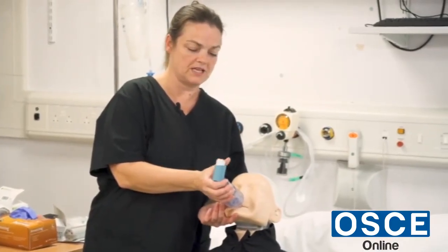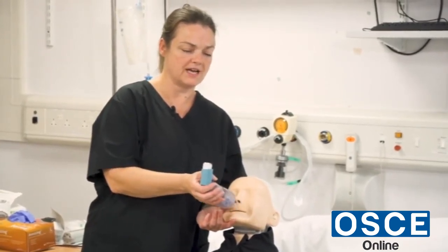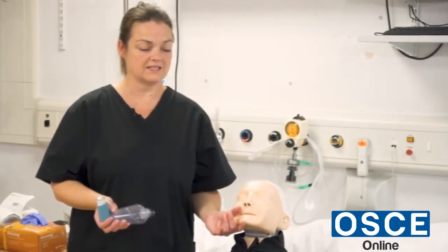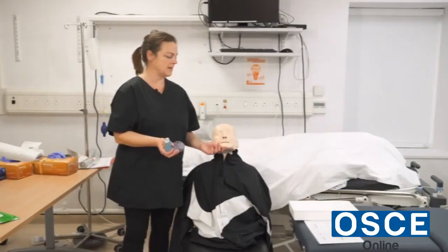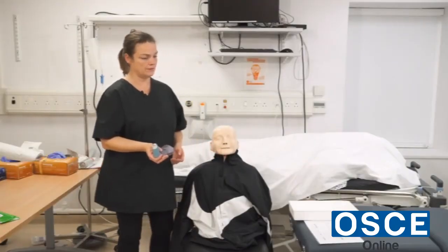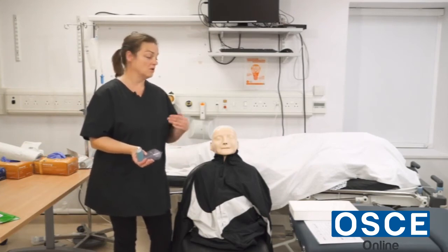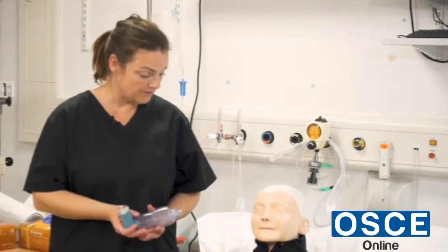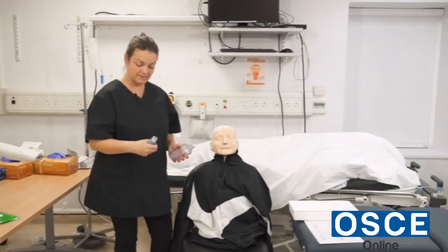I want you to breathe in over 2 to 3 seconds. Okay, hold that for 10 seconds. 3, 4, 5, 6, 7, 8, 9, 10. Breathe out through pursed lips. Okay, so I'm going to give him a 20 to 30 second break. 30 seconds has elapsed. Are you okay? Do you feel ready to have another inhalation? Yeah, he said he's fine.